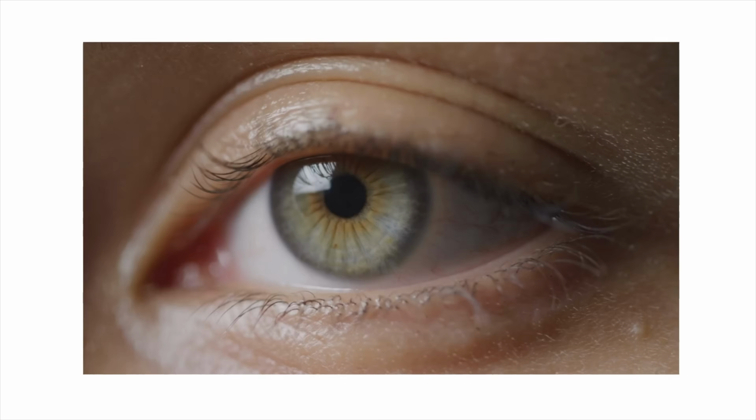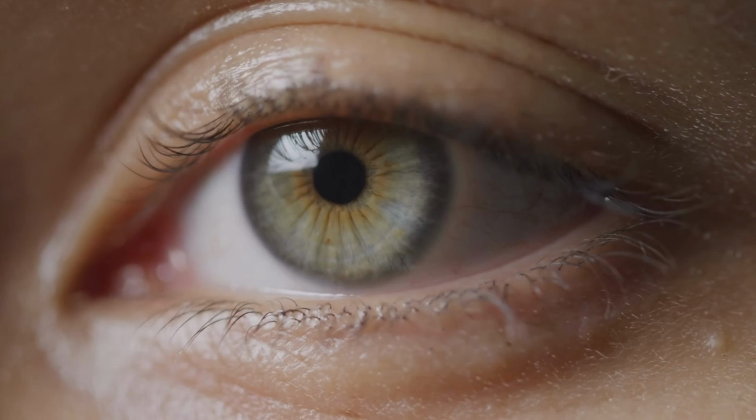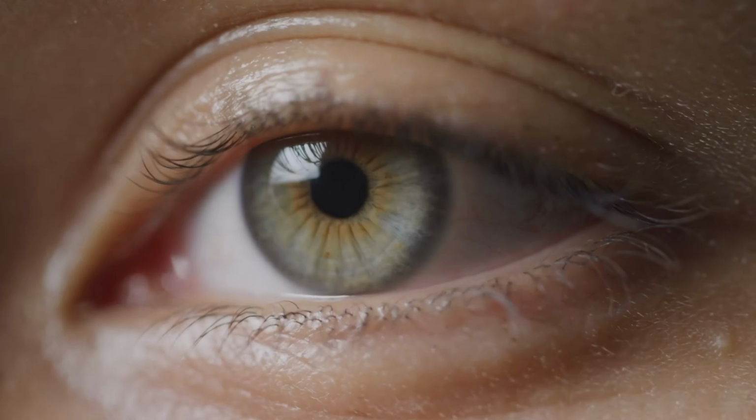This is also good for us to document because some patients, their eye will not look like dry eye. In fact, it'll look pristine and perfect, but they're still having these symptoms, and that tips us off that perhaps it's not dry eye. In fact, it could be a neuropathic pain issue. So again, just a good thing to document.